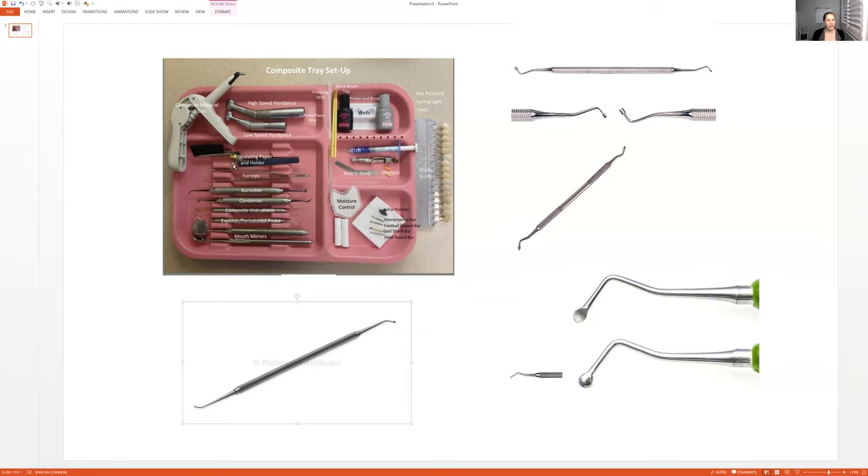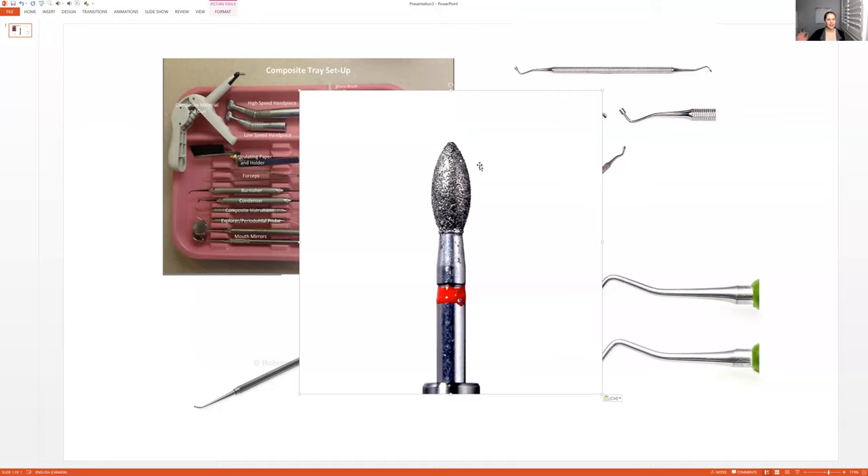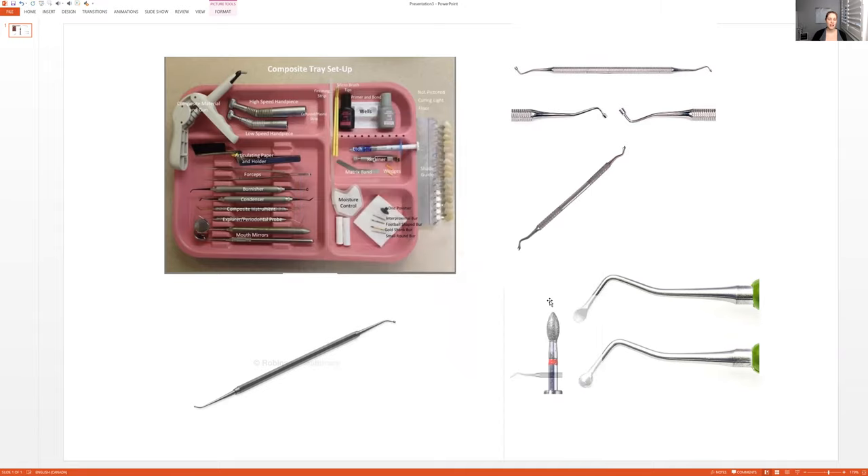If there are high spots — which there usually are — they would take the high speed and usually a football-shaped burr to polish it up and carve down the high spots. Sometimes it's a football diamond burr, sometimes just a normal football-shaped burr, but this is what they use to polish and carve down high spots. They will do this several times — take the high speed with the football burr, polish it up, then check with the articulating paper again. You don't want to over-polish or take away too many spots. So they take away a little bit, check with the articulating paper again, polish down more, check again, and polish more until they are absolutely happy with how it looks.